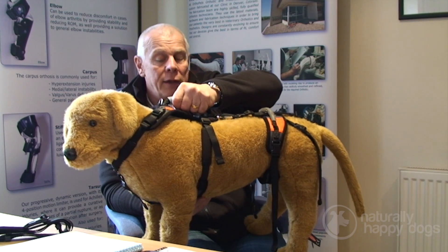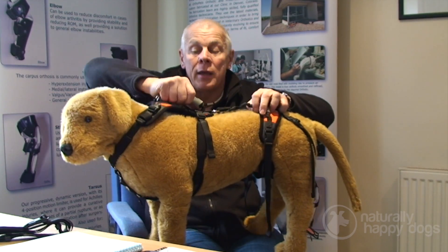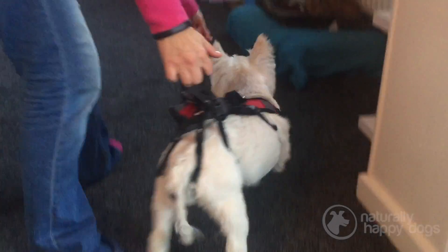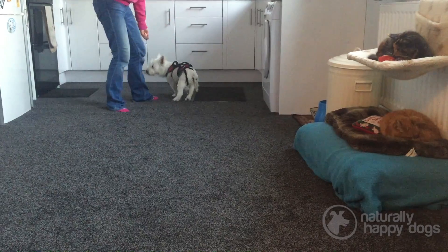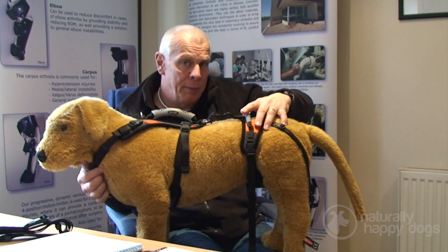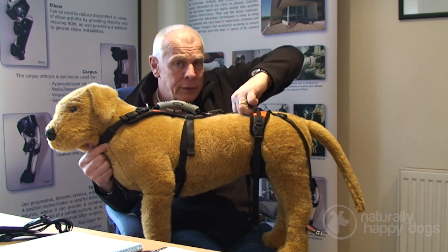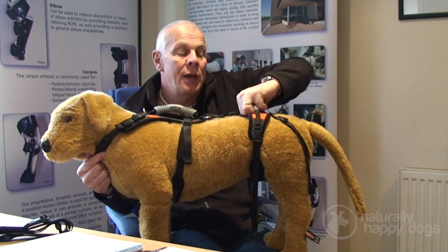It's a two-piece affair. It's got a good handle here for you to grab hold of, so if your dog needs a bit of help at the front, you can lift it there. The hip lift section at the back is designed to lift and support at the pelvic girdle — so you don't have to put a towel around the stomach, which can cause the dog to urinate as soon as you lift it due to too much pressure in the wrong place, leaving the dog bent over like a banana and looking very uncomfortable. The hip lift section also has a handle, so if it's the back end you need to hoist or stabilise, you can hold on to it there.